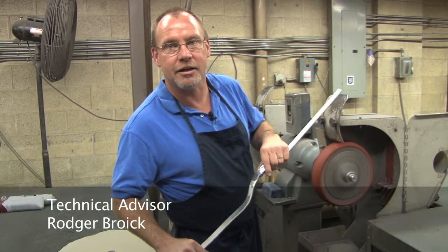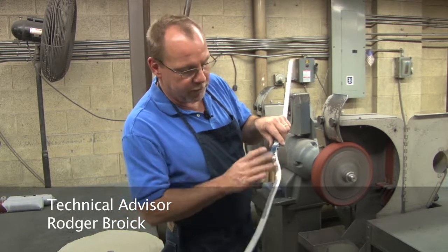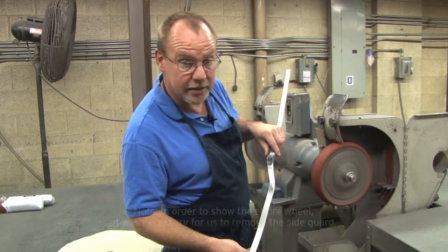Hi, my name is Roger Breich. I'm the technical advisor here at Becker Orthopedic. I wanted to show you a method of removing stress risers from aluminum and stainless steel.